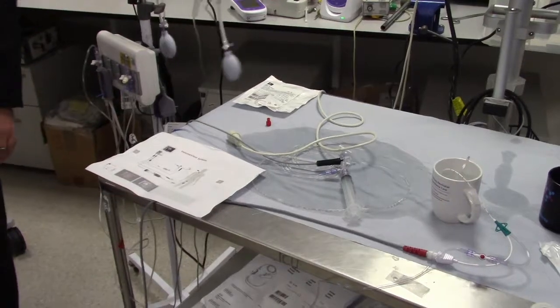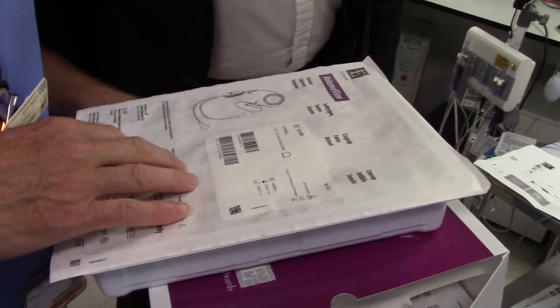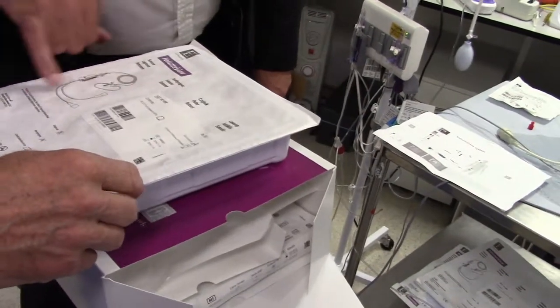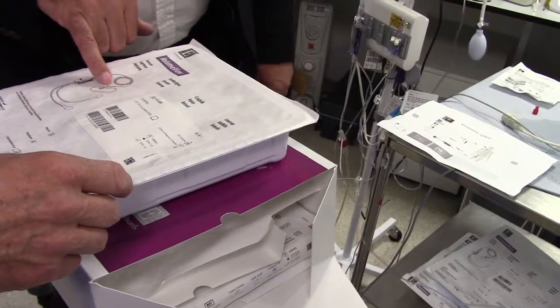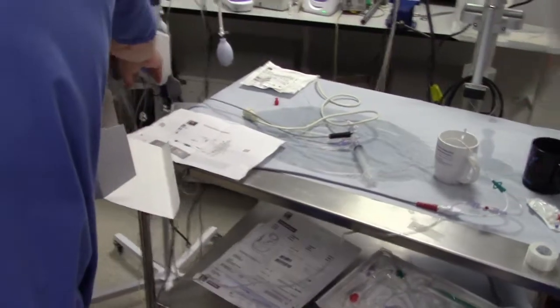And you can't see. Oh, brilliant. Well, that's just the transducer set. So that's what you get in there. So you see you've got a stopcock on here. Where you're talking about sampling and connecting this to the femoral catheter, this would normally have a stopcock on there as well. So is this included in this?